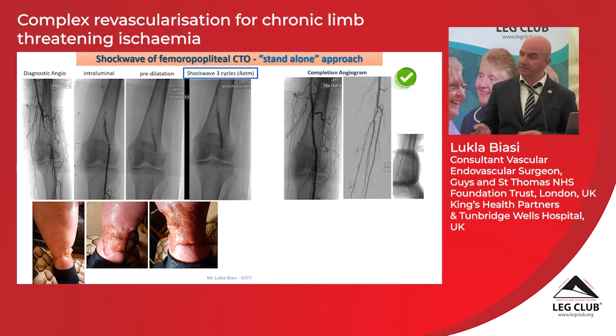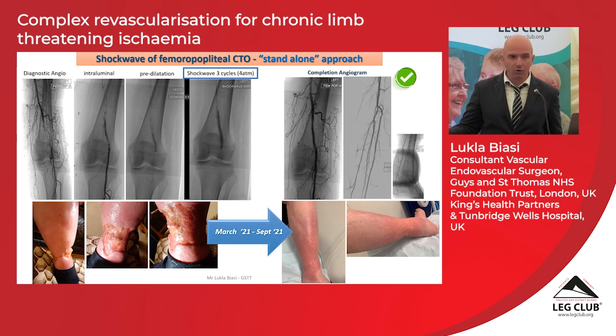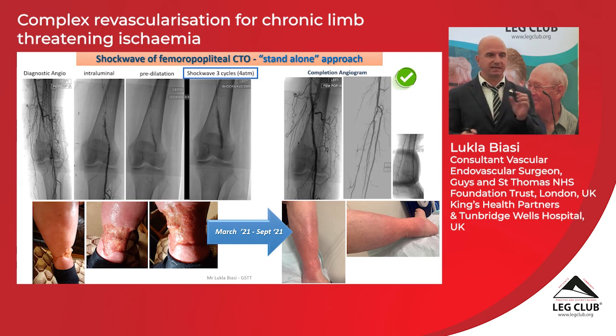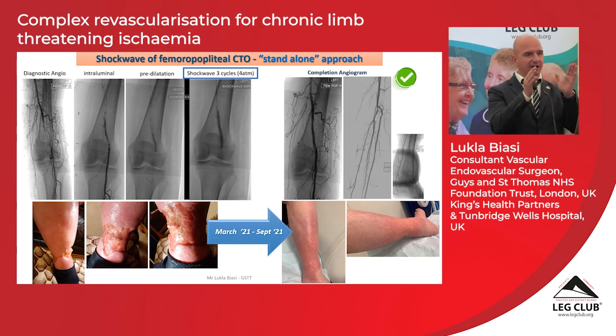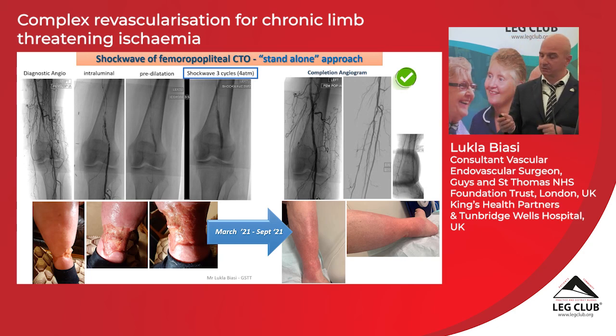So in the case of this lady, I used the intravascular lithotripsy balloon. Okay, it looks like a normal balloon, but the difference is that it's not exerting any pressure. This is a balloon inflated at just 4 atmospheres, meaning it's just touching the artery, it's not applying any pressure, it's not tearing the wall of the artery, it's not squeezing the plaque, it's just sitting there. And at that point, the sonic wave starts doing the job, breaking down the calcium, and with no additional requirements, the artery was restored to normal and with no embolization.